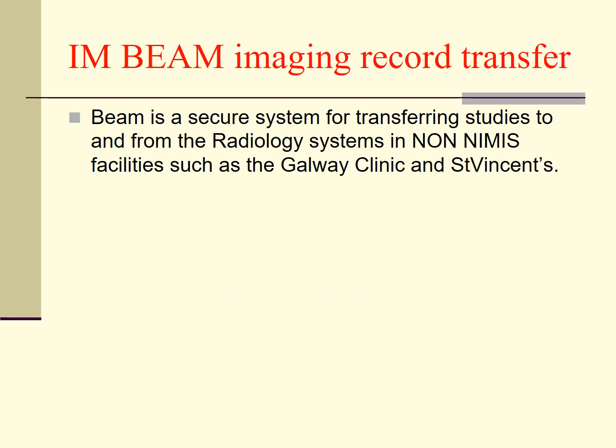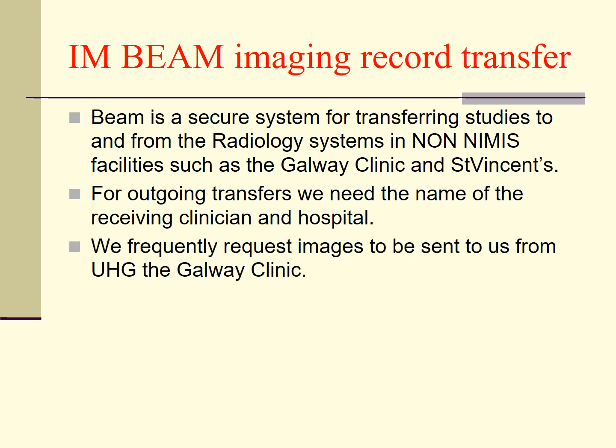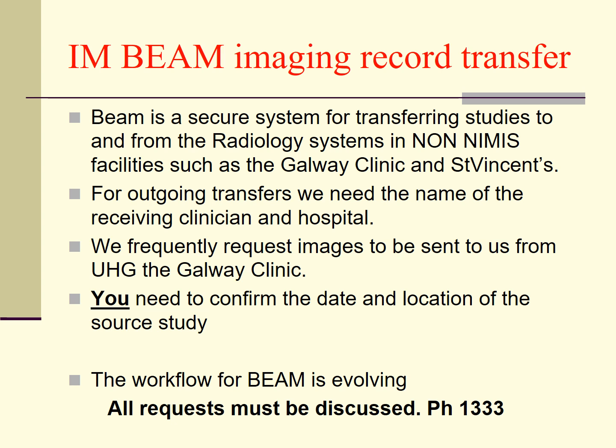BEAM is a secure system for transferring studies to and from the radiology system in non-NIMIS facilities such as the Galway Clinic and St Vincent's University Hospital. For outgoing transfers, we need the name of the receiving clinician and hospital. We frequently request images to be sent to us from University Hospital Galway and the Galway Clinic. You need to confirm the date and location of the source study. The workflow for BEAM is evolving. All requests must be discussed. Phone 1333 or call in to the PACS office.